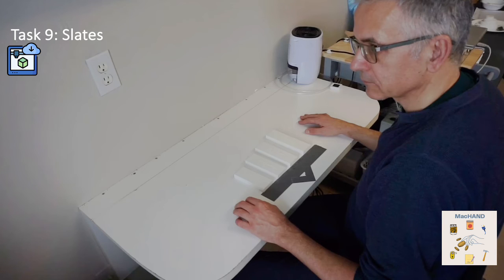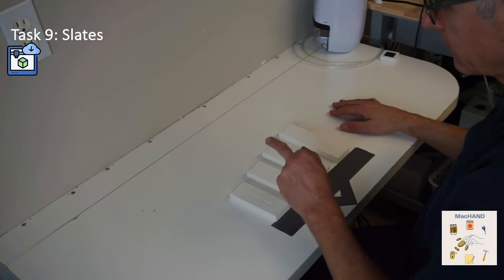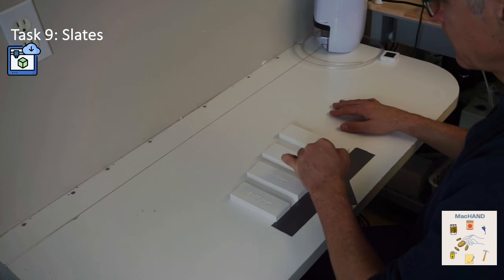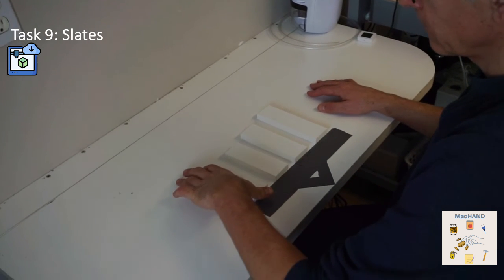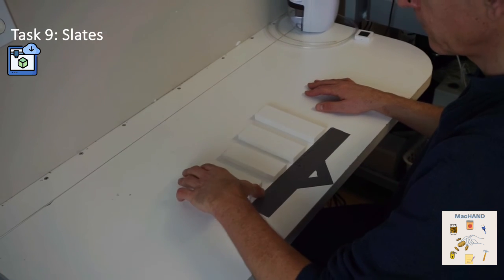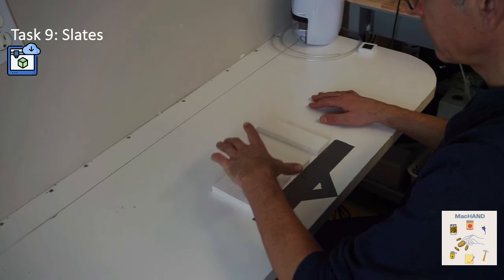This next task asks the patients to pick up slates with their thumb and designated combination of fingers and then put them back on the table. This is mentioned at the beginning. Slate A with index, B with middle, C with ring, and D with small. The slates are placed on the tape line on the table with the smallest one closest to the tested hand. The assessor's focus is on the span.